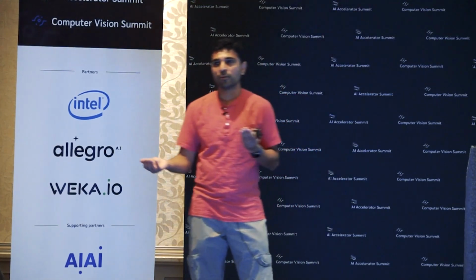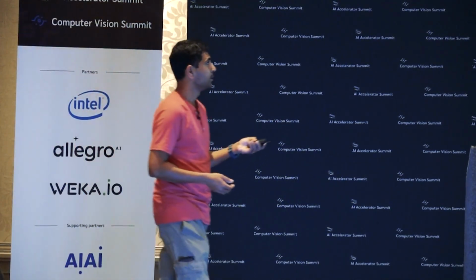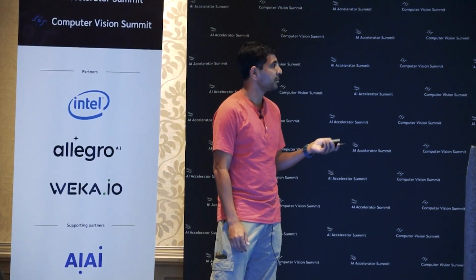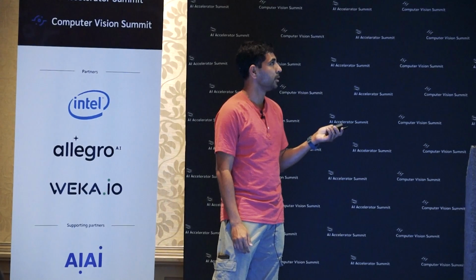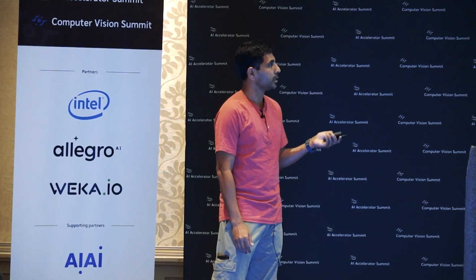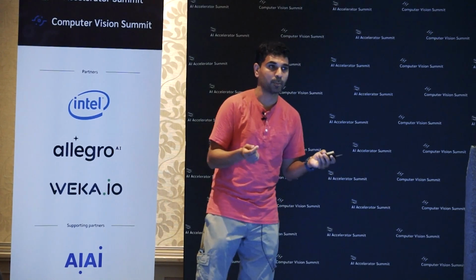Okay, now that we have diagnosed gallstones, let's say the next step is to remove the gallbladder. The procedure to do that is called cholecystectomy. And similar to what Max was showing, there are 7 steps really, going from preparing the patient to clipping and cutting the gallbladder, taking it out, packaging it, and then eventually closing up the patient, right?